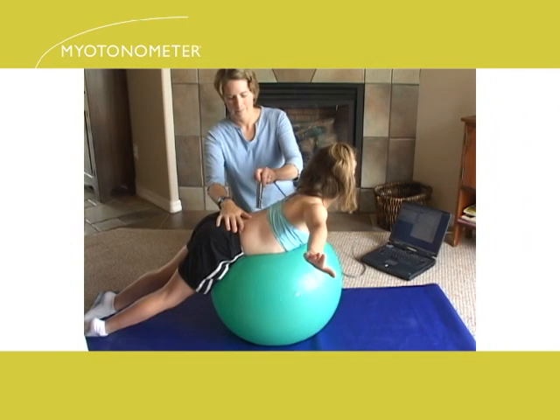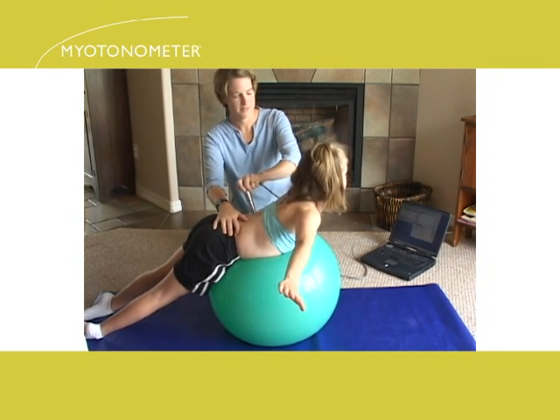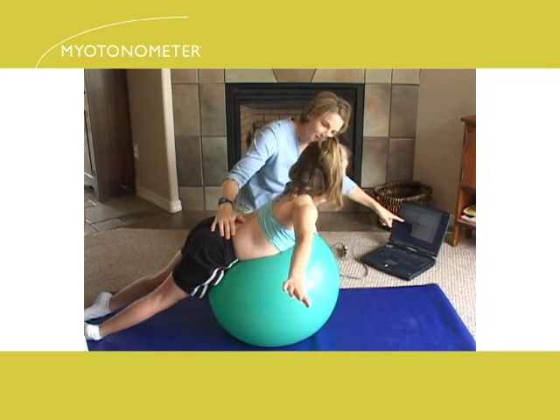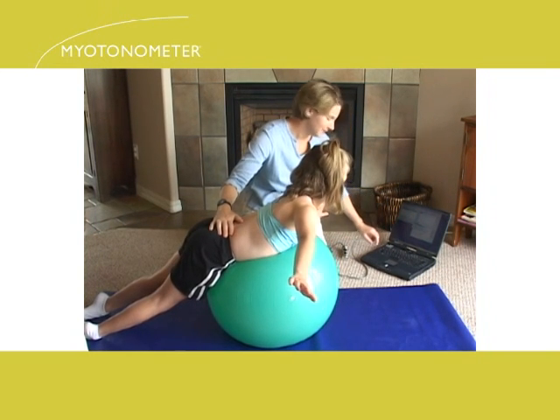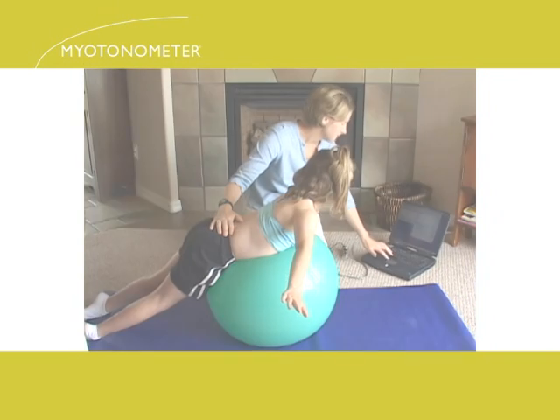In the case being shown, this girl is asked to exercise her back muscles. With an increased effort, muscle stiffness increases. She's being shown how well she's doing. Data can be saved to show her progress over the course of time.